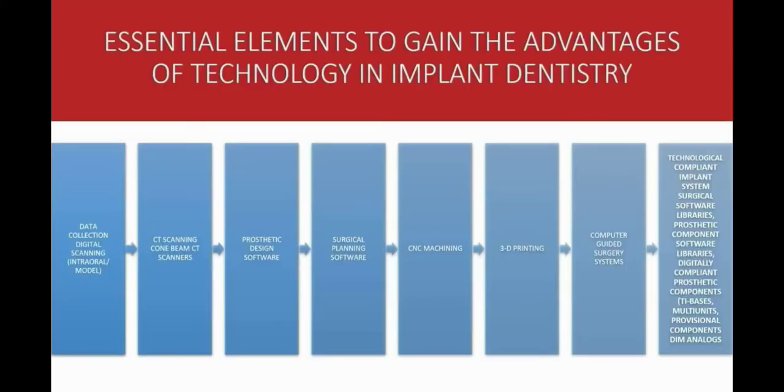Let's review some of the essential elements to gain the advantages of technology in implant dentistry. Surface scan with the intraoral scanner or optical scanner, cone beam scan, prosthetic design software, surgical planning software, CNC machining, 3D printing, computer-guided surgery systems, and a technologically compliant implant system.